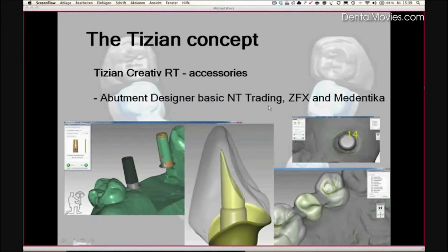If you work with a 4-axis machine, or if you have the possibility of a 5-axis milling technology, then undercuts and implant axis deviations are possible to mill.